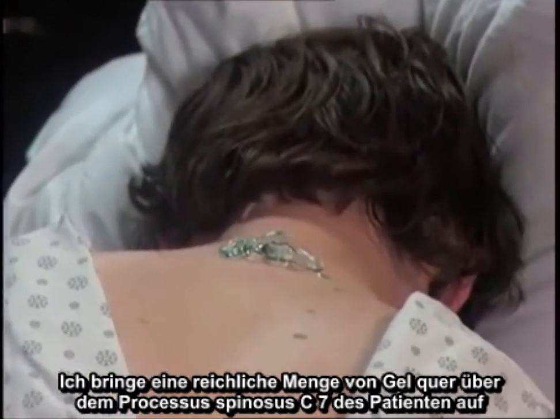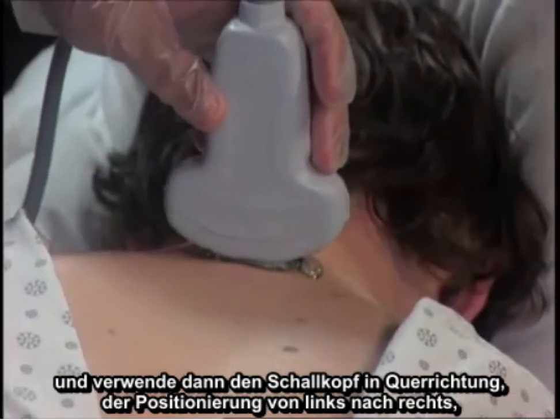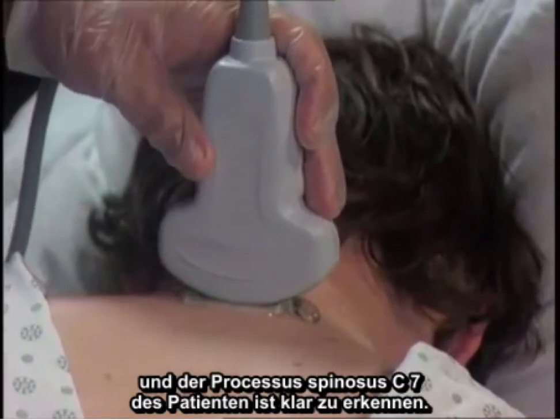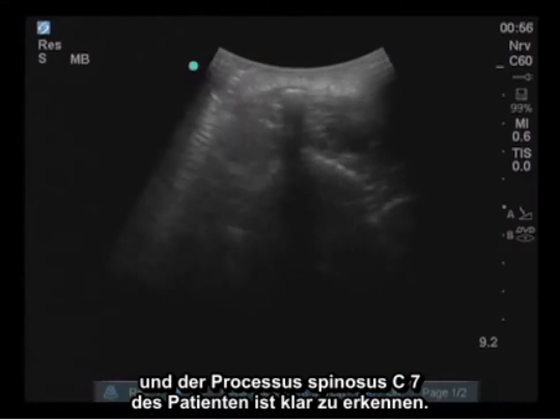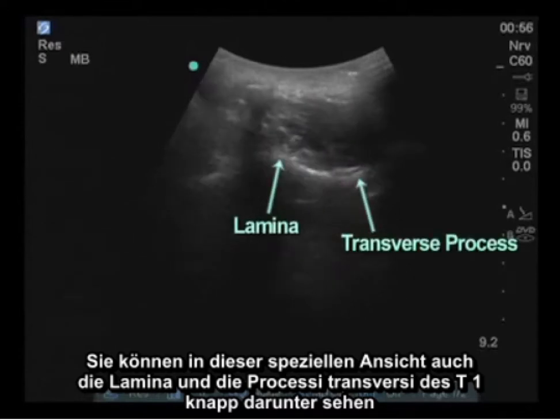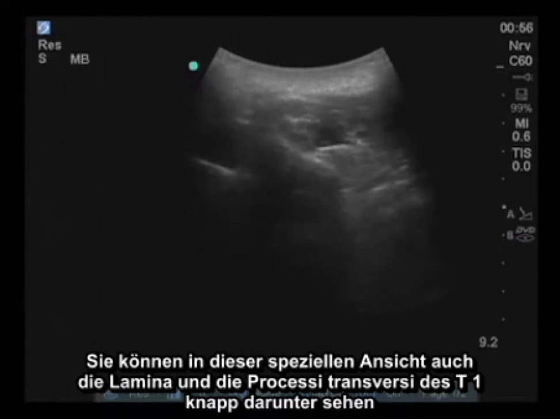I place a copious amount of gel across the patient's C7 spinous process, and then utilizing the probe in the transverse — that is the left to right positioning — I place contact on the skin. Clearly visible is the patient's C7 spinous process. In this particular view you can also see the lamina and the transverse processes of T1 just below.